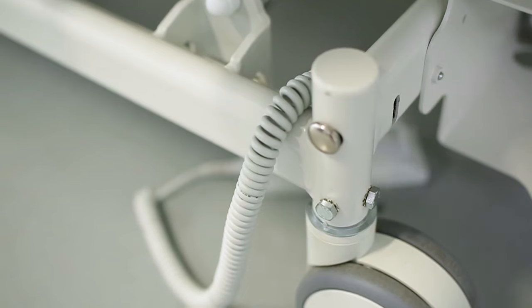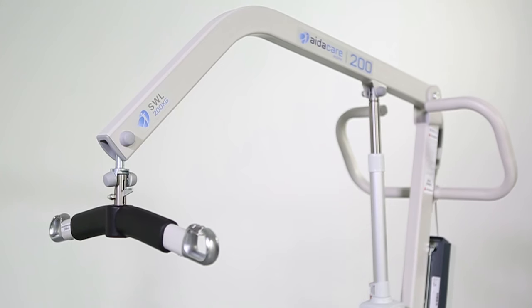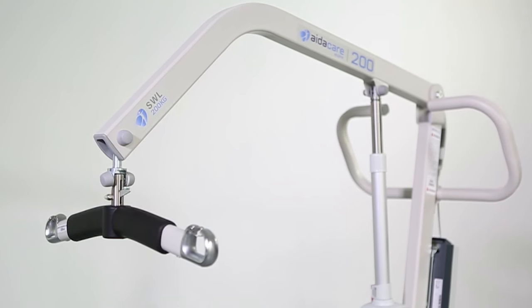Before you begin any lift, always carry out a risk assessment for both your safety and that of your resident. Check that the environment is clear of hazards and is uncluttered. Check that the equipment you're using is in good condition. Check that the resident is safe to lift and explain to them what you are going to do. This is all part of your dynamic day-to-day risk assessment.